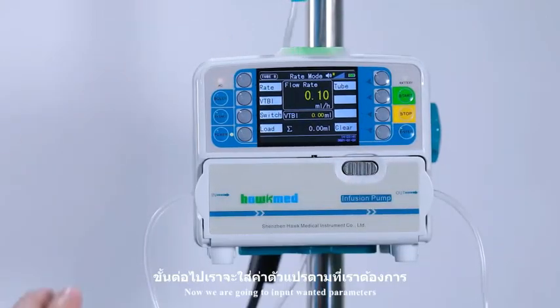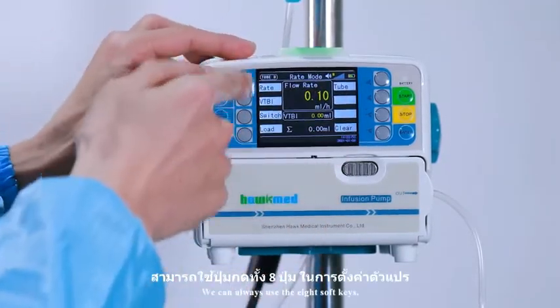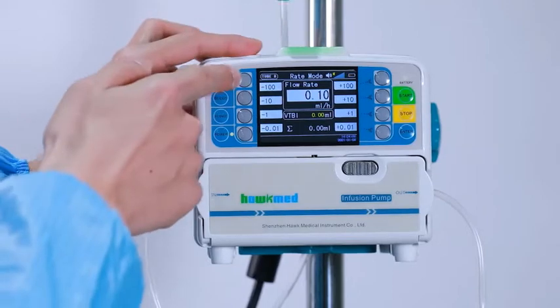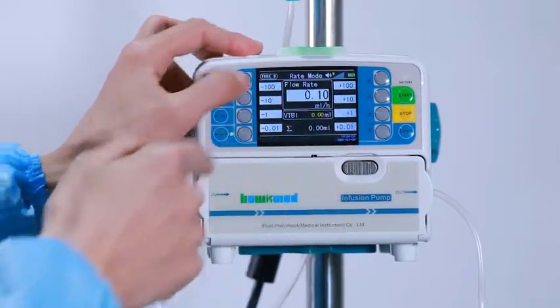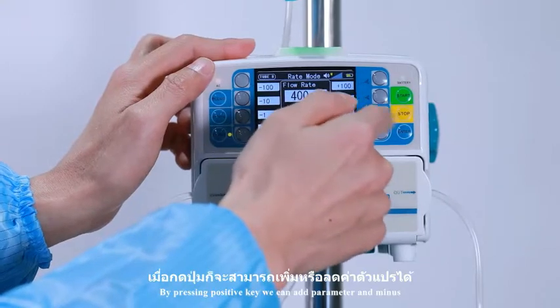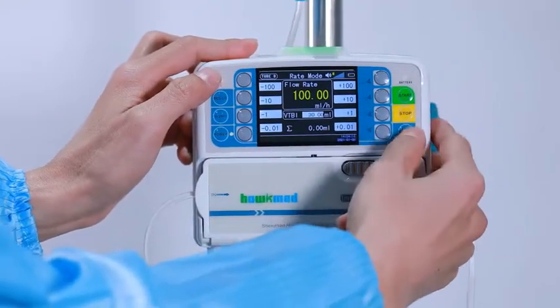Now we are going to input the wanted parameters. We can always use the 8 soft keys. Press the soft key — negative or positive. By pressing the positive key, we can add to the parameter, and minus to decrease it. Press enter. Input VTBI. Press enter.